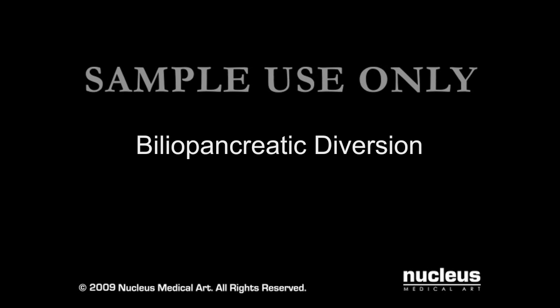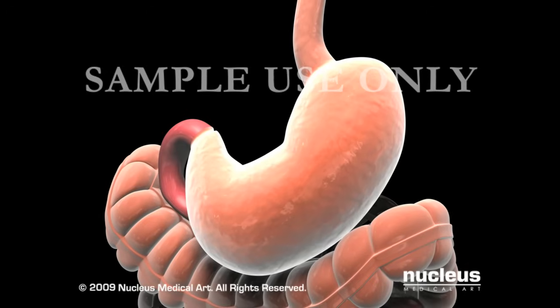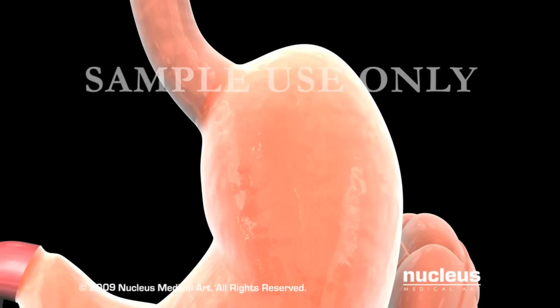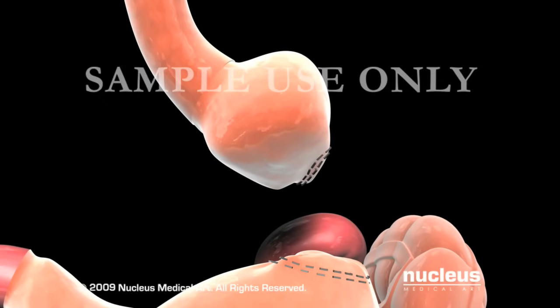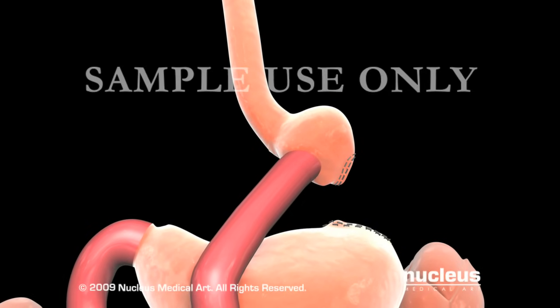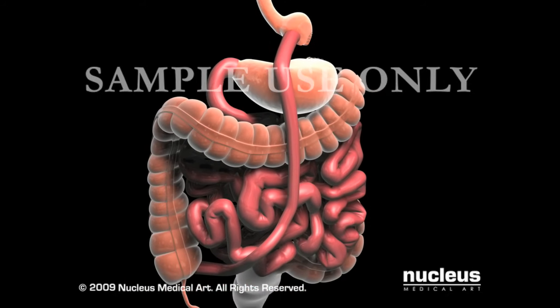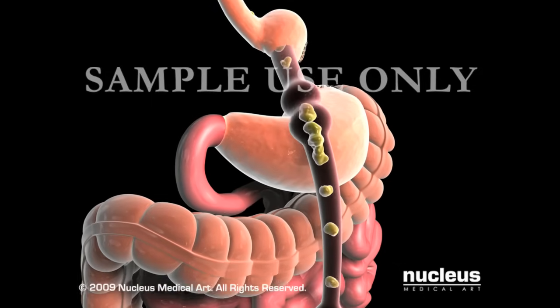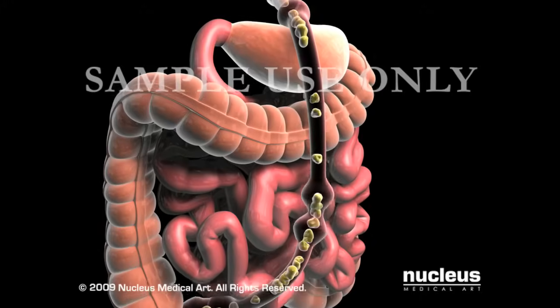Biliopancreatic diversion is a malabsorptive procedure that decreases the amount of calories absorbed in your small intestine. Your surgeon will begin by removing part of the stomach, leaving only a small pouch behind. Next, he or she will sew the small intestine to the pouch. This creates a direct route from the pouch to the end of the small intestine. The duodenum and jejunum are bypassed, so few calories and nutrients are absorbed.